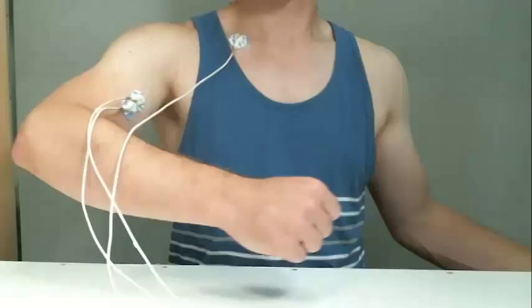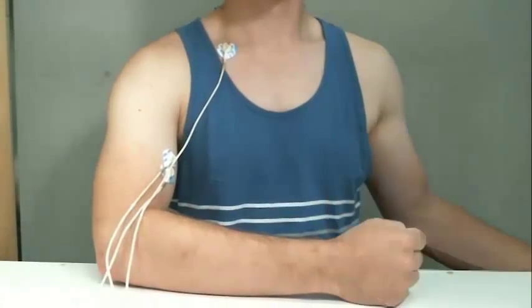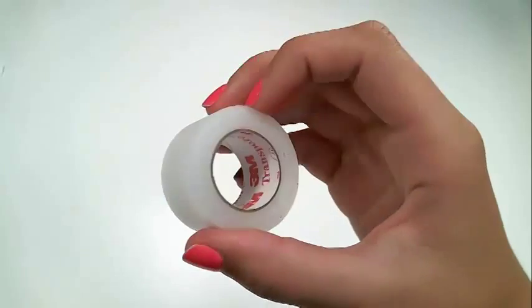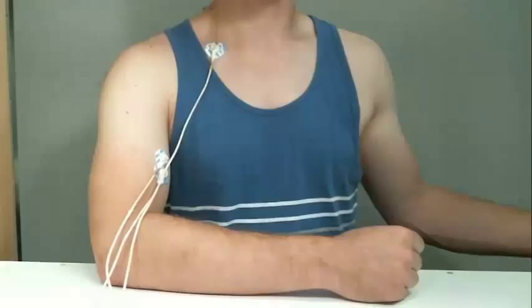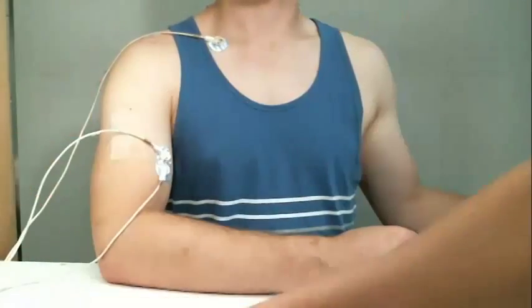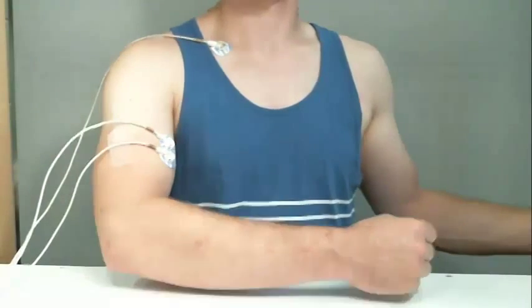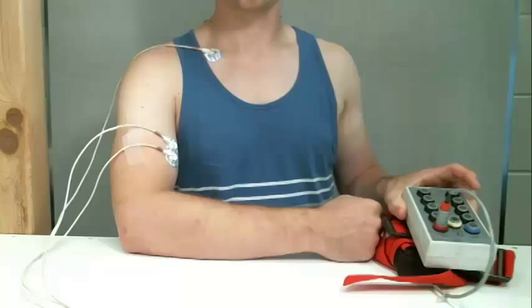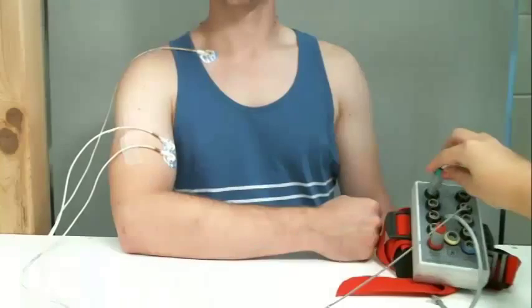Swinging leads cause noise in the signal, so make sure that the cables are secured appropriately. Tape the lead to the skin with enough slack to allow for unobstructed movement. Attach the other end of the lead into the EMG portable unit. Now you are ready to collect an EMG signal.